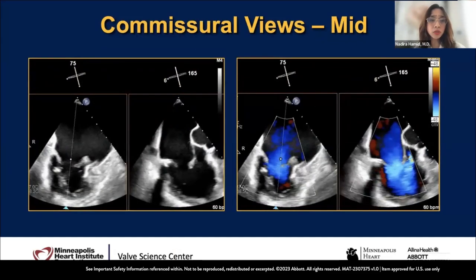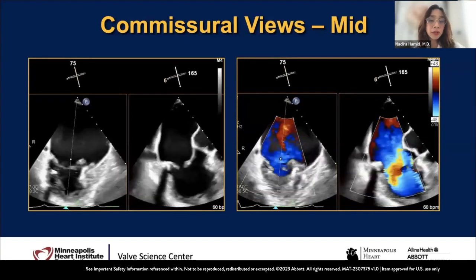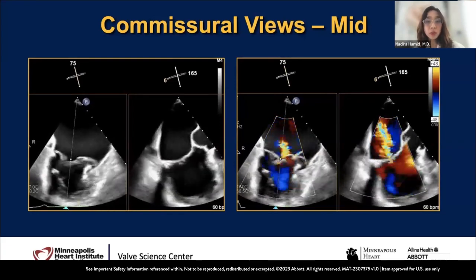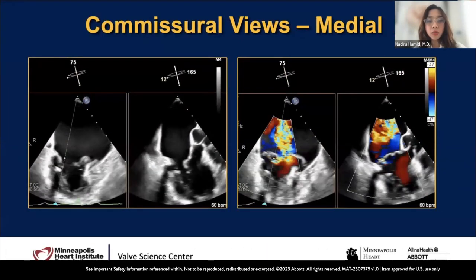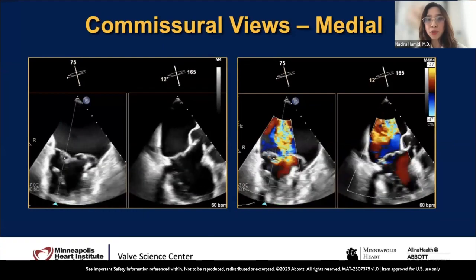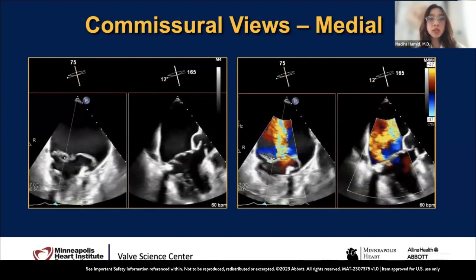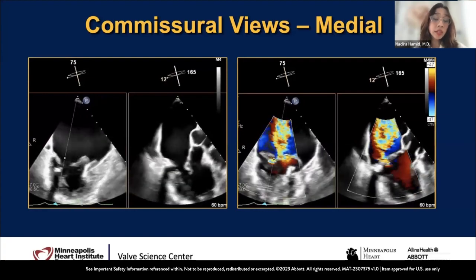And also then moving along to your mid, as you move the biplane imaging to the mid, I take color and no color in the same spot, showing Ryan as well, hey, this is where a lot of the jet still is. So you have a lot of the jet laterally and also in the mid A2P2. And then you sweep again to the medial side, not only looking at where the jet is. I think, Ryan, the other key point that you'll be looking out for is the length of the posterior leaflet, right, Ryan? And seeing the length of the grasp. And if the length of the leaflet is adequate for an NTW or an XTW, those are the key consideration points that you want to think about in your decision making in terms of the selection of clips for these kind of cases.